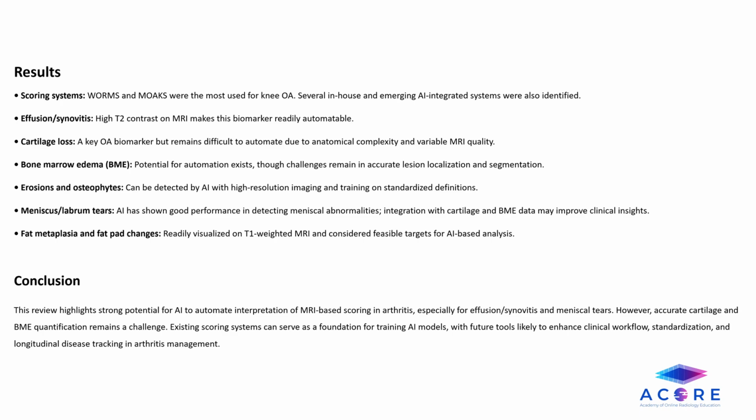WORMS and MOAKS were the most commonly used scoring systems for knee osteoarthritis, and several in-house and emerging AI integrated systems were also identified. High T2 contrast on MRI made these biomarkers for effusion and synovitis readily automatable. Although cartilage loss is a key osteoarthritis biomarker, it remains difficult to automate due to the anatomical complexity and variable MRI quality when trying to assess cartilage of the knee.